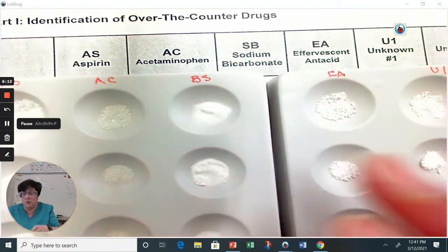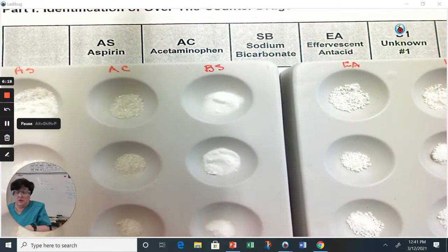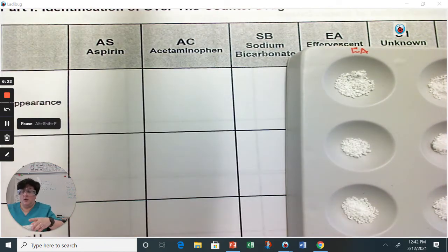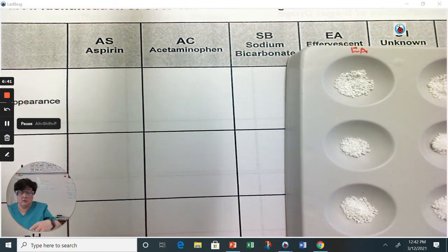I am going to pick the well plate up. You can watch me in the video, the part of the screen that is focused on me. I'm just going to pick it up and add the water directly in, squeezing very gently so I don't spray the material outside of the well. I'm going to fill the well to the top, go to the next well. Fill that to the top, go to the next well. Okay.